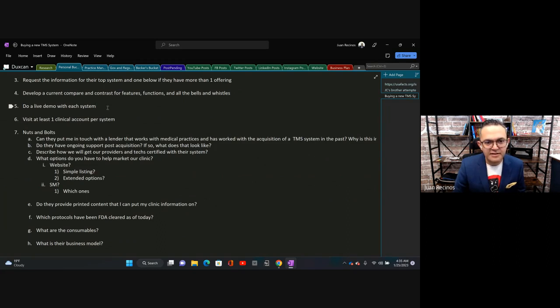Want a live demo for each system. So that means myself and my CMO go play with the machine, check out the system. It should be a very fun experience, but it should be very tailored to how am I going to use this thing on a daily basis? I don't want to just walk into a room and see a system. I want it turned on. I want you to show me everything it does.